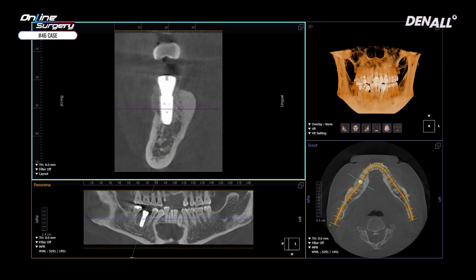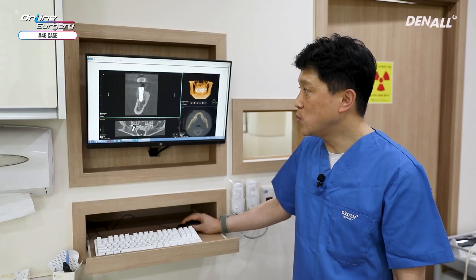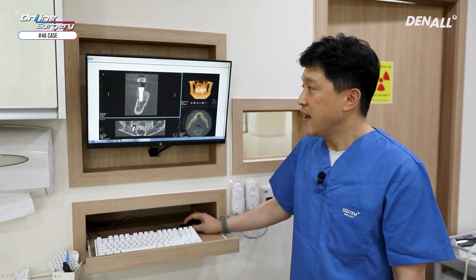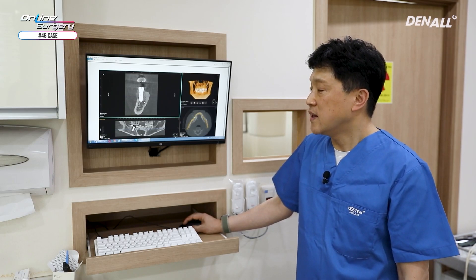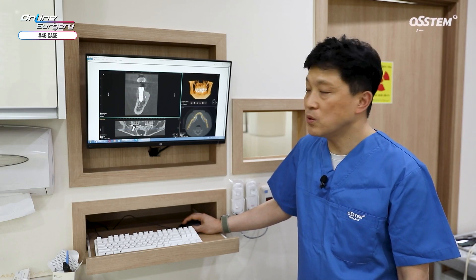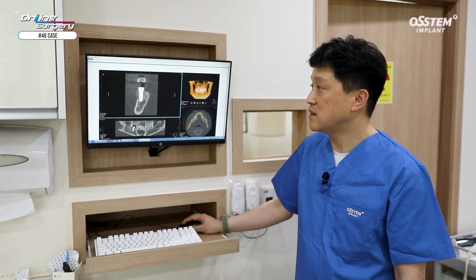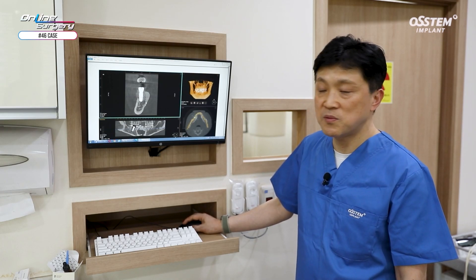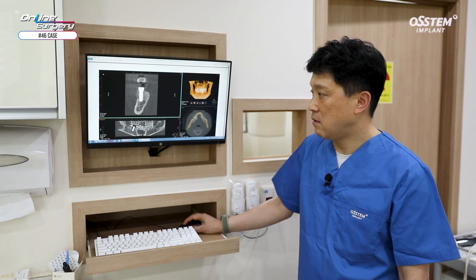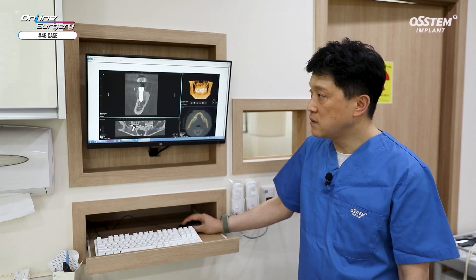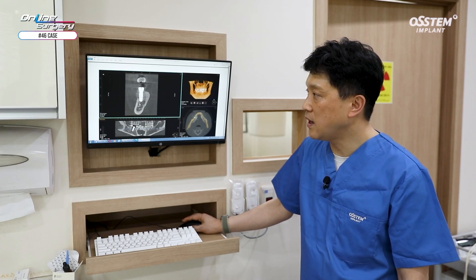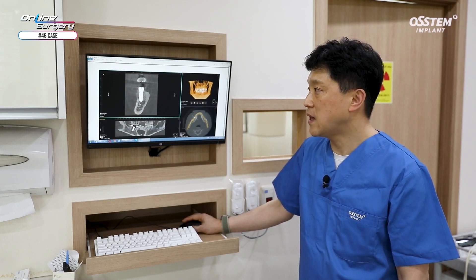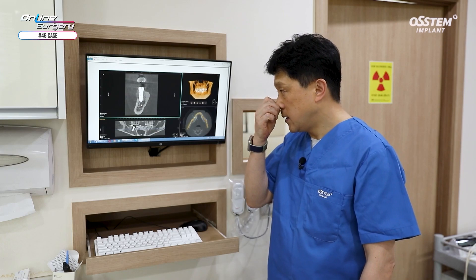It seemed as if significant grafting was done, but it wasn't. The implant is slightly placed buccally because the bone on the lingual side was harder — although we kept this in mind when we performed the surgery, this was the result we got. In these cases, you need to place the implant significantly more lingually to achieve the ideal implant placement position. Membrane stabilization was done, as well as internal and external socket grafting, so I think it will not affect the long-term stability of the implant nor the prosthodontic steps. Significant bone regeneration was required for this patient, so the prosthesis will be delivered at approximately 16 weeks.